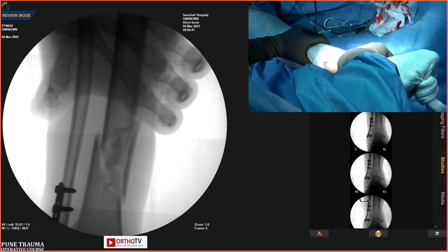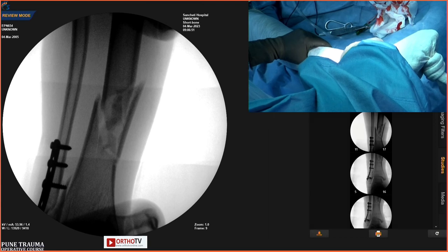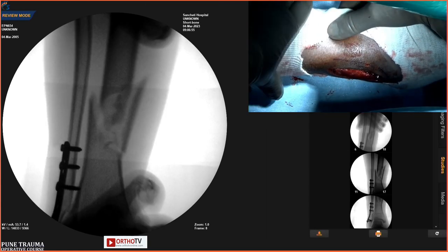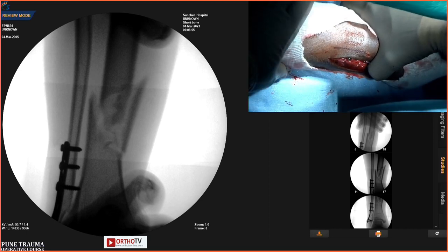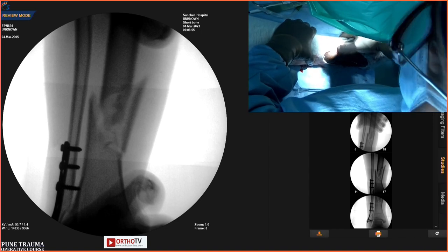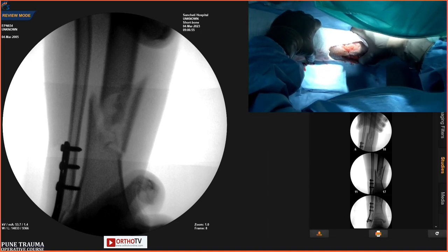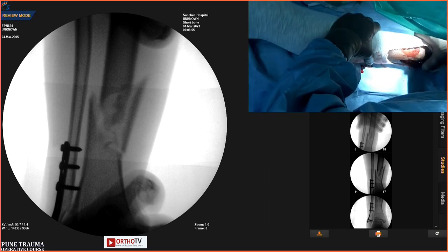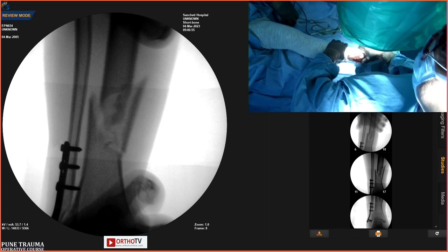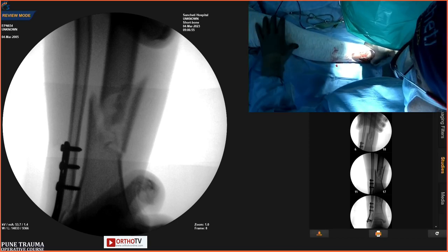And this is the closed reduction of the tibia that I'm getting. So if the fibula is reduced well and fixed well, the tibia falls into place. Yes, it makes your life easy. Now, like suggested, I may not hesitate to undo the fibular fixation if required. But definitely, it would give me an advantage if the fibula is aligned in order to reduce the tibia.